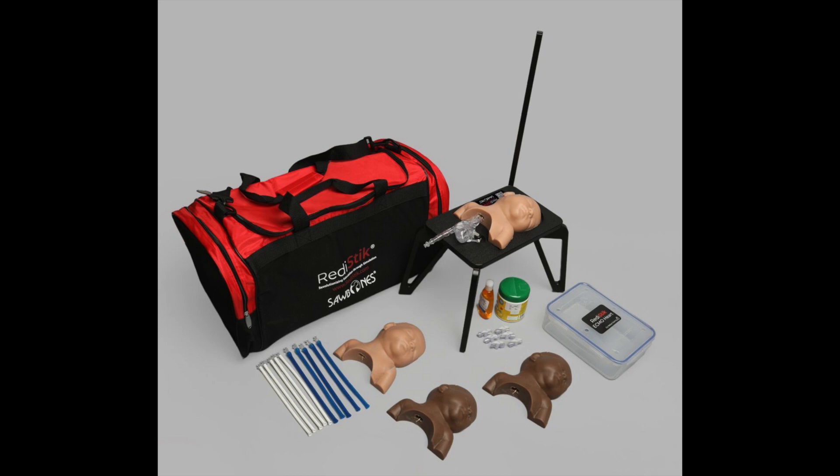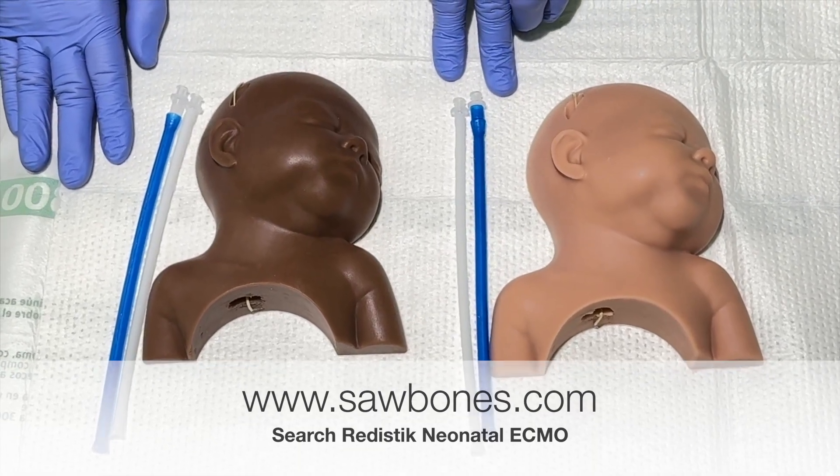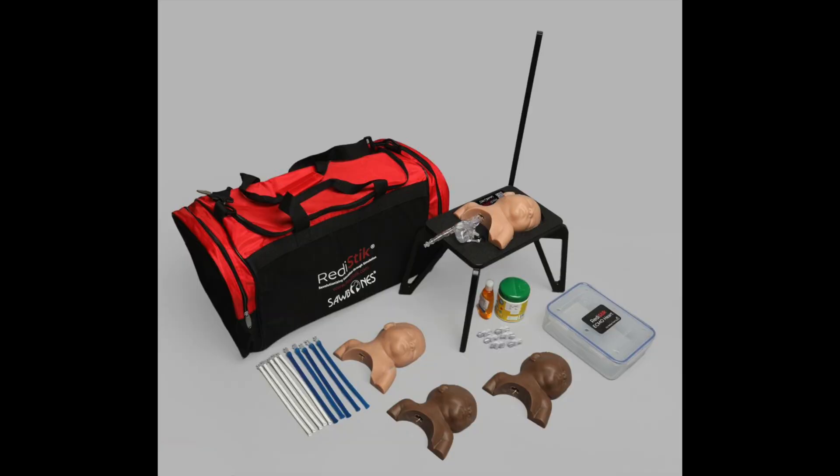The starter kit includes four necks — two light tone and two dark tone. Each neck comes with an internal jugular vein and a carotid artery. We have replaceable necks and replacement vessels that can be ordered separately, and you can also reuse a cut neck and put in fresh vessels.